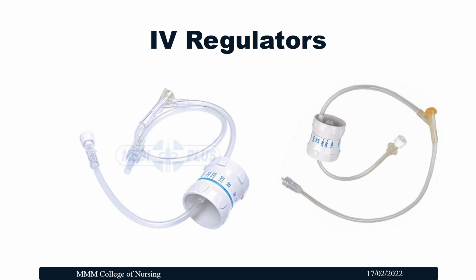These are the manual IV regulators. This helps to regulate the flow of fluid from 5 ml to 250 ml per hour. This is approximate. We can administer the fluid at a maintained flow rate.